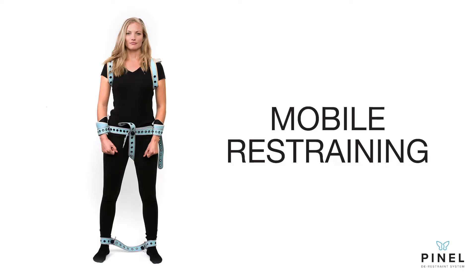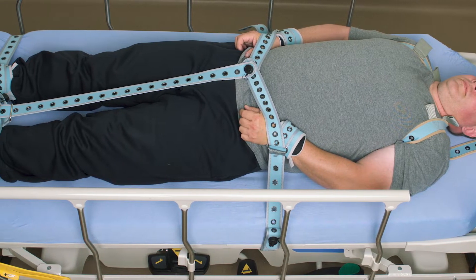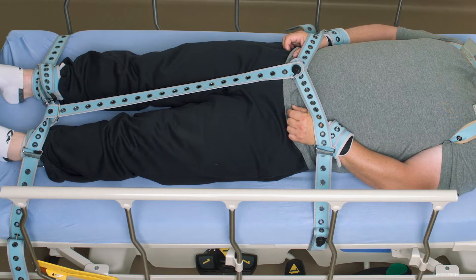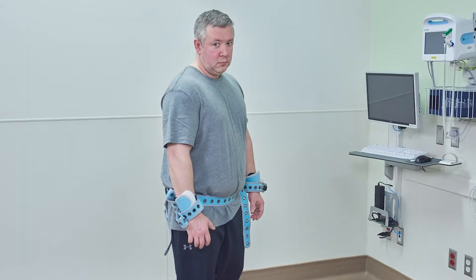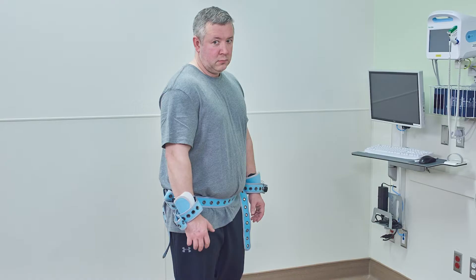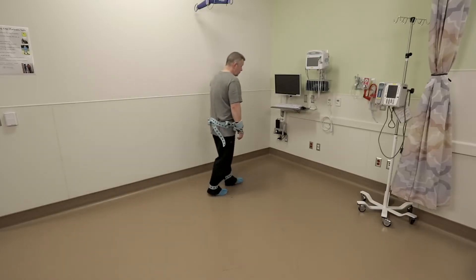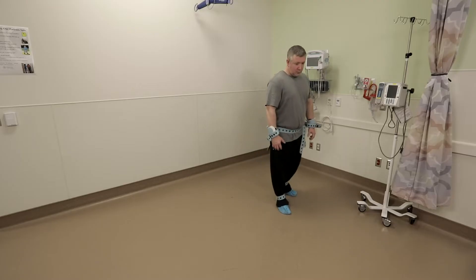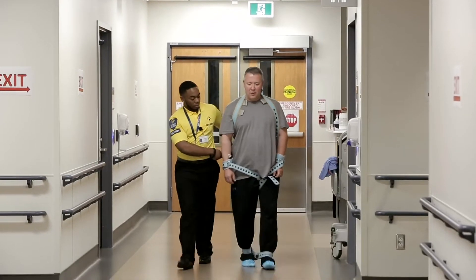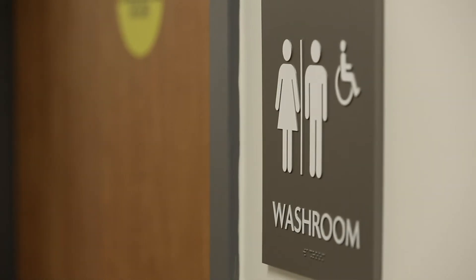One of the unique features of the Pinel system is the ability to convert the system from a seven-point restraint into a mobile or transfer restraint. Prolonged restraining presents a high risk of deep vein thrombosis. Walking improves blood flow in the large leg muscles and reduces the risk of blood clotting. It also reduces anxiety and embarrassment by allowing a patient semi-private washroom privileges.